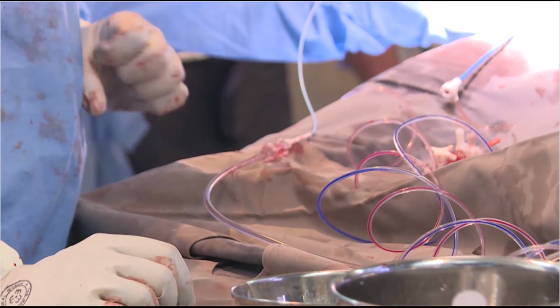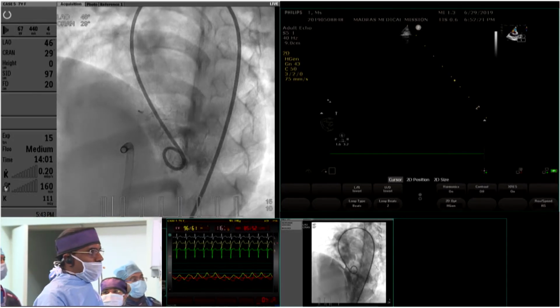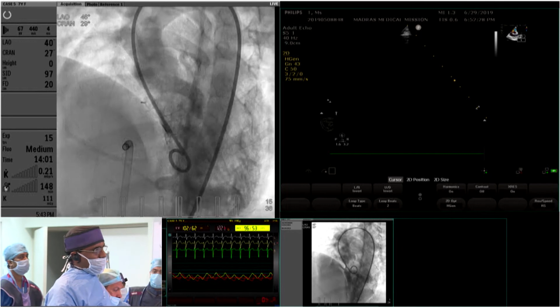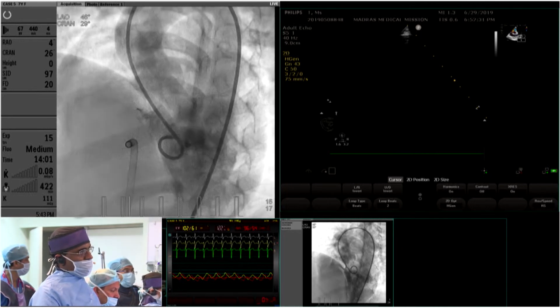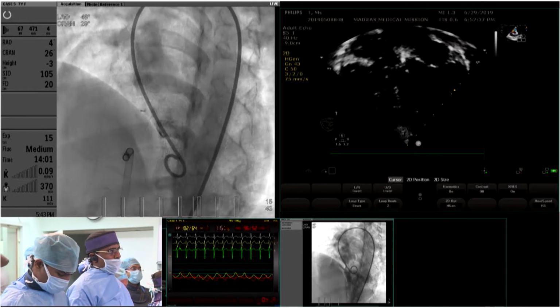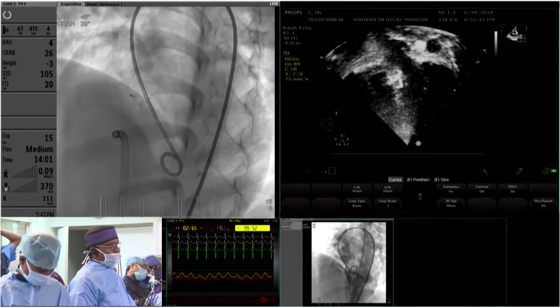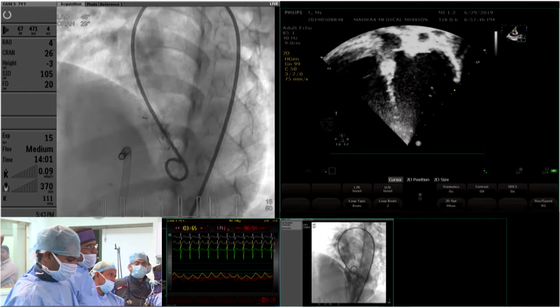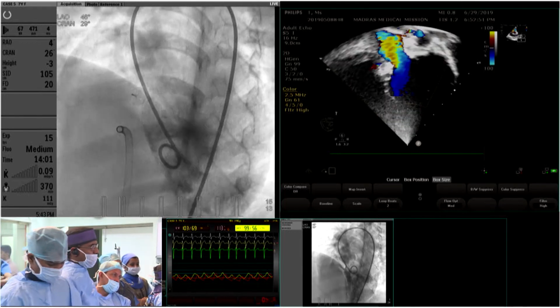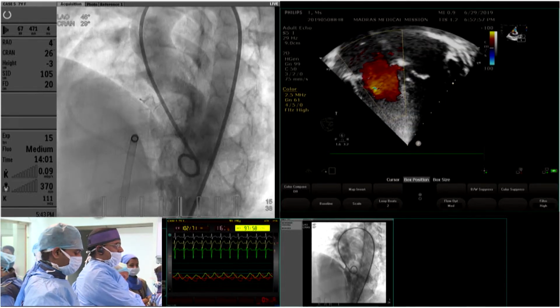So this was an Occlutech perimembranous 6mm device. We are in the central waist part, we are not actually oversizing. The reason, so the chances of a radial stress stretch on the margins of the VSD causing an injury to conduction is possibly less likely. Since the device has got a peculiar shape where the RV disc actually keeps moving away from the right ventricular wall, there is no clamp on this device. So it's hoped that the chances of AV nodal conduction disturbances are possibly a little less, even though some sort of proper studies have to be done.